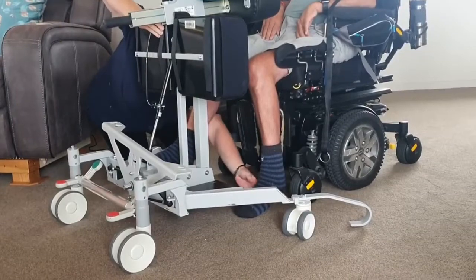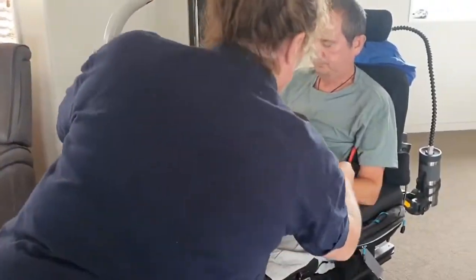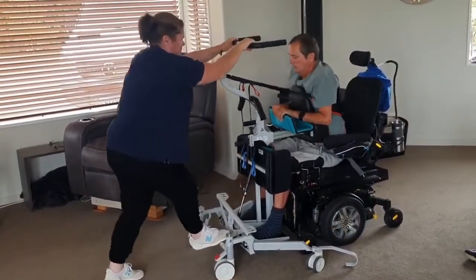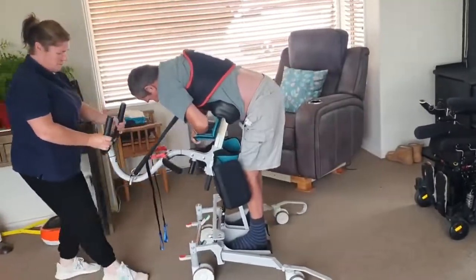Hi, I'm Steve. I've got MMD, so I've got no use of my legs and very limited use of my arms. But with the Carer, you don't even need use of your arms or legs, and it's been really good because the time involved in using it just to move is fantastic.